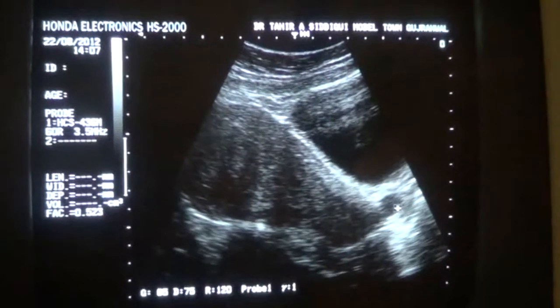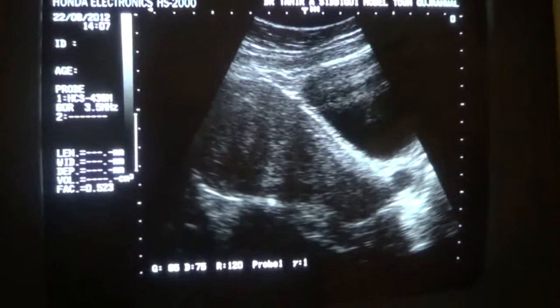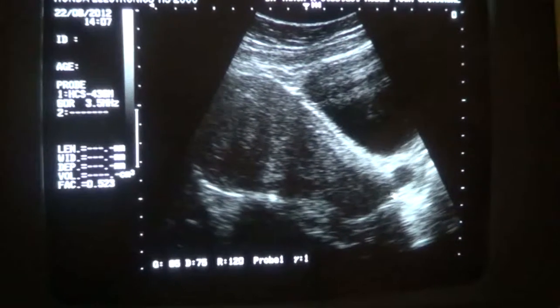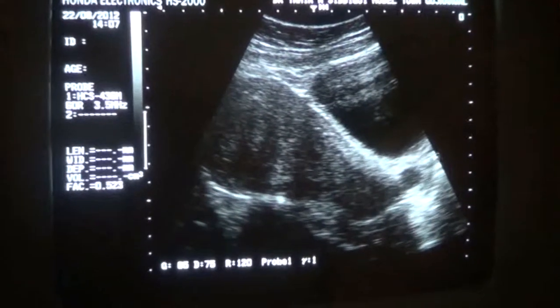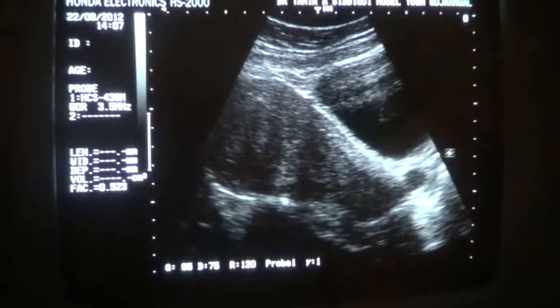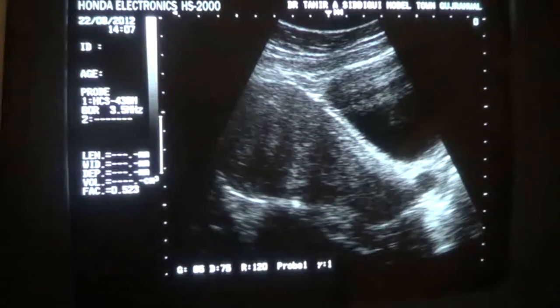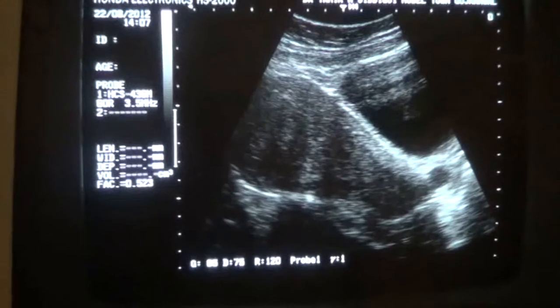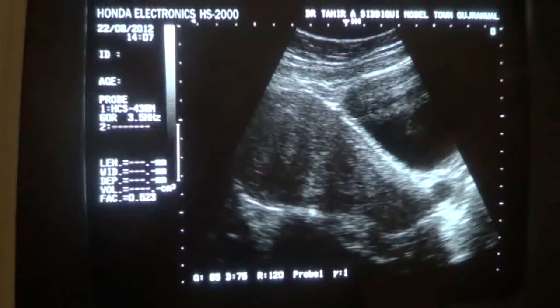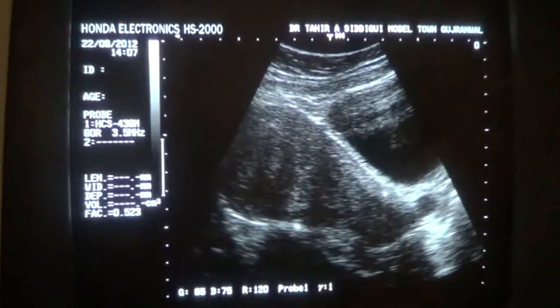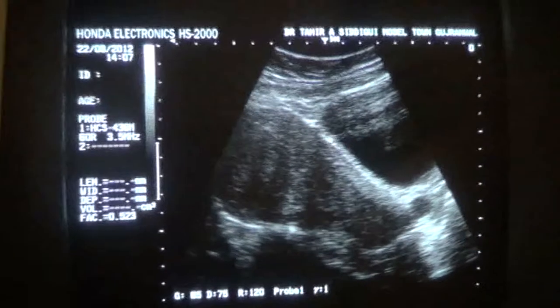Here we are seeing a small cystic area with no posterior acoustic enhancement. This is the vaginal layer. Now this is the cervix, and this is the Nabothian cyst. This is the anterior wall.